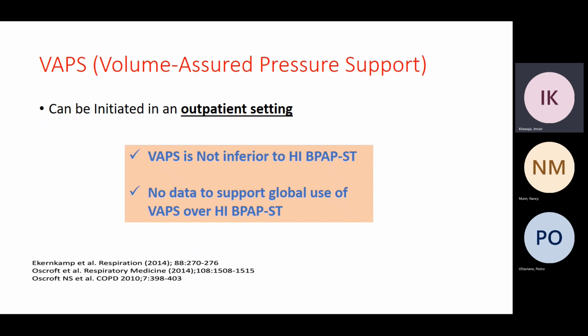So sometimes what I do is, when I know this patient has recurrent exacerbations and I see him as an inpatient, I look at the BiPAP settings and what is the volume that he has achieved while he's in the hospital on those BiPAP settings, and was it sufficient to treat him? At least when I discharge this patient, if everything works right, he will come back to my clinic. Do you look at it every day, every night, or just one time?